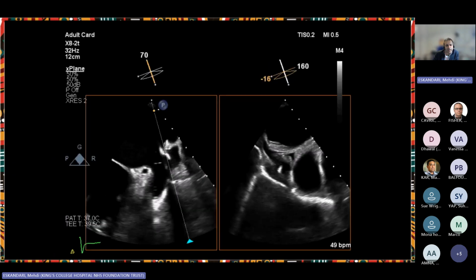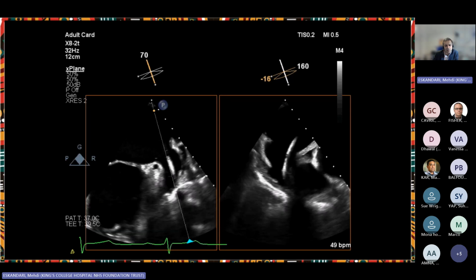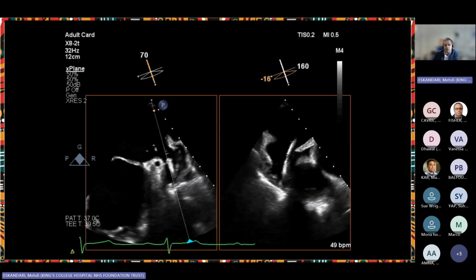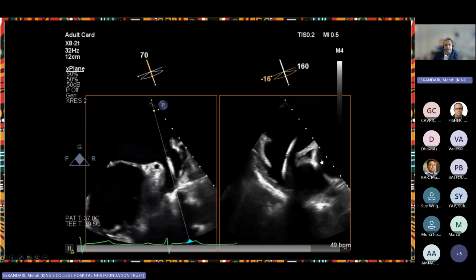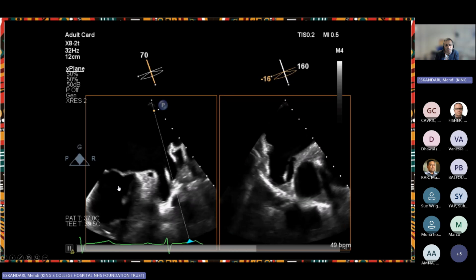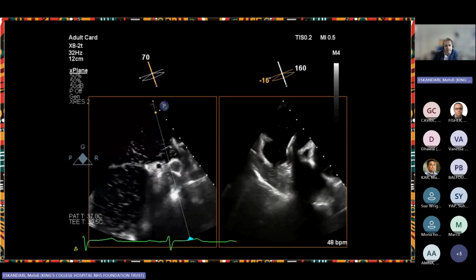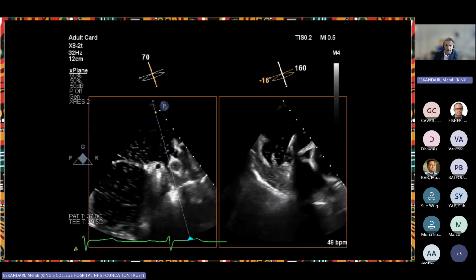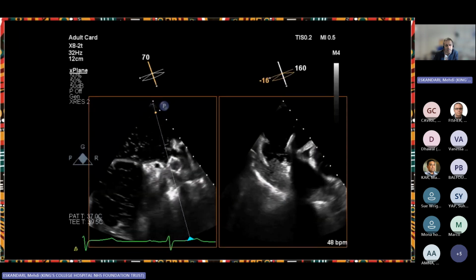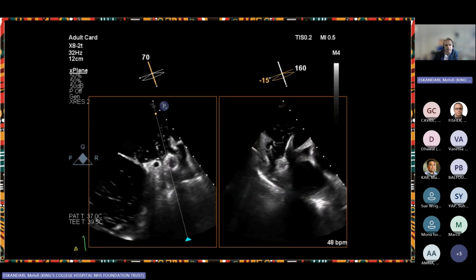So that's the puncture we talked about. Coaxiality to the landing zone is important. The left side is your short axis view. Biplane imaging will give you the long axis view. That's the pulmonary artery here, and that's the appendage and mitral valve. Next step would be to put the sheath in and open the lobe of the device. The recommendation is that two thirds of the lobe should be beneath the left circumflex artery. So that's where they try to do it.